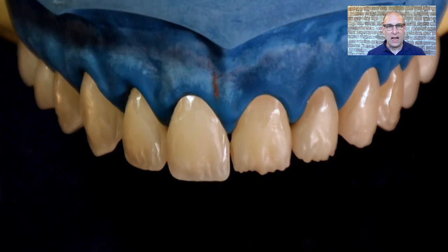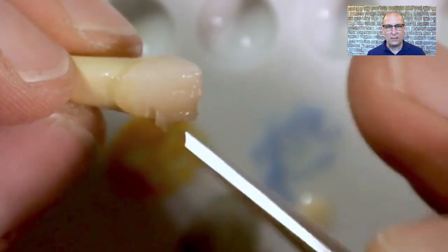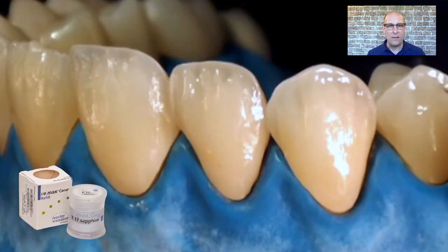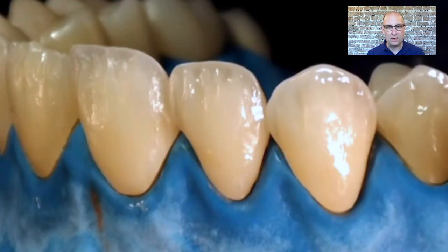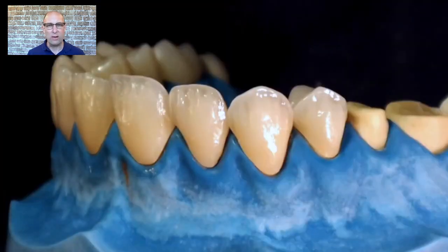Welcome back. On the right side I've used a dentin cutback and on the left side a facial cutback. I already finished the wash bake for the units. On the dentin cutback I added a thin layer of IvoColor glaze paste flow and some IvoColor dentin shade at the gingival to enhance the chroma. On the facial cutback at the incisal I added IvoColor sapphire, which gives the incisal edge the illusion of transparency. It's still a full contour lingual and most of the light is getting blocked, so the sapphire gives it that incisal look. I also added a bit of IvoColor gray between the mamelons to create more depth.